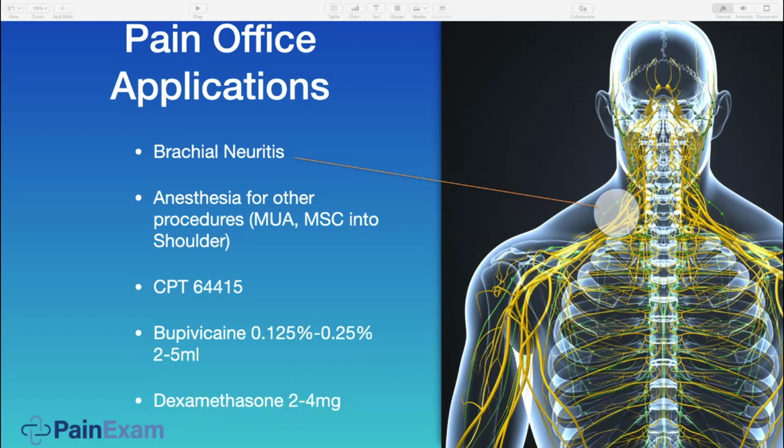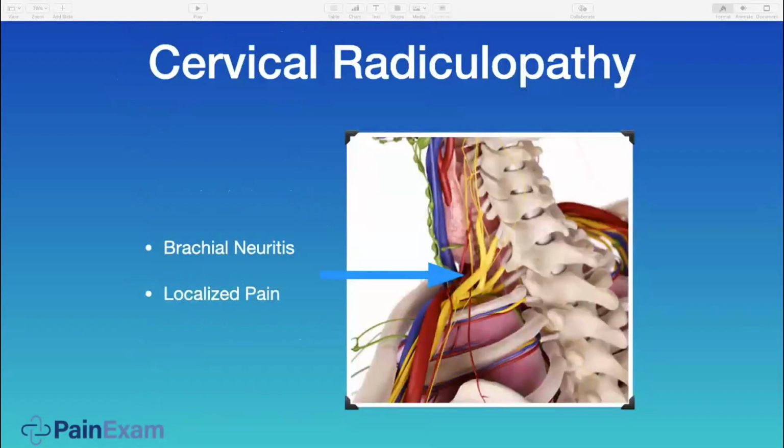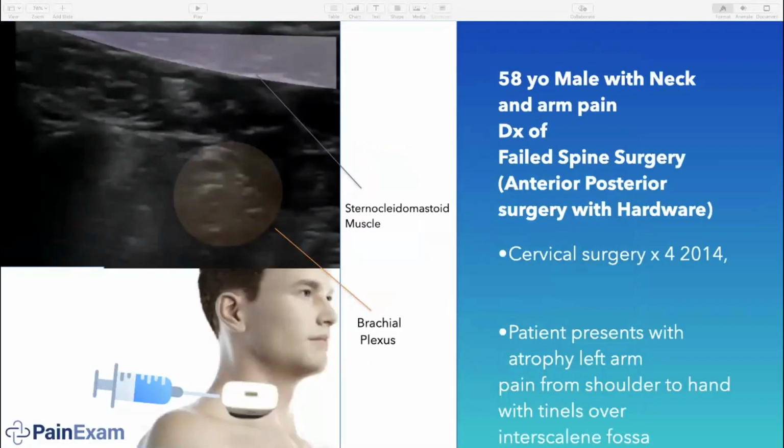Now, I don't do this every day, but I do it every so often when I feel that the pain is coming proximal. Oftentimes, I'm doing the selective nerve root block with a lower volume, and I'm tracing up from the interscalene nerves, which we'll get into later. Okay, once again, here's an idea. You see the cervical nerve roots exiting the spine, how they come together in that classical location where the patient reports pain when they have a cervical radiculopathy.